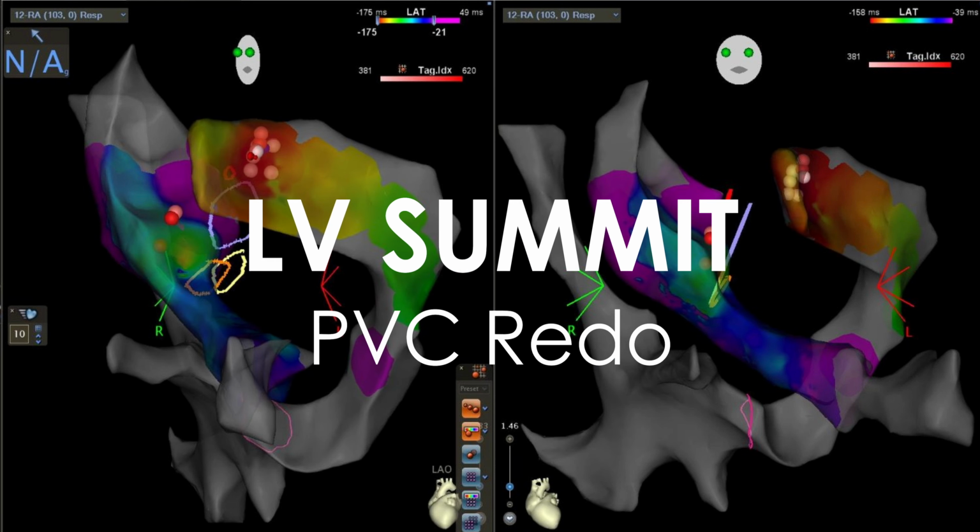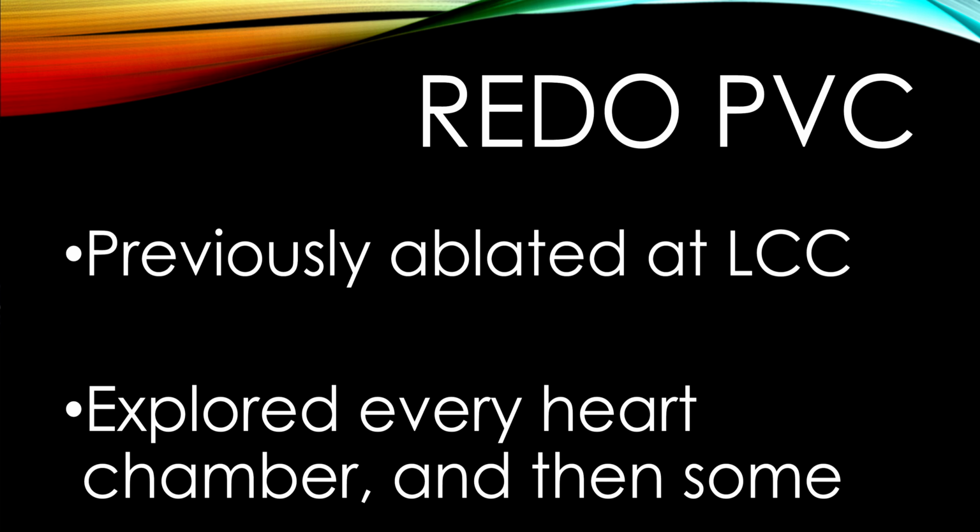This was an interesting case we got to do last week. Patient came in after previously being ablated for a PVC that was unsuccessful. This time we found it at the LV Summit. Previously ablated at, I believe, just underneath the left coronary cusp with an RMT catheter. We ended up going on quite the exploration through all 4 chambers of the heart and then some.